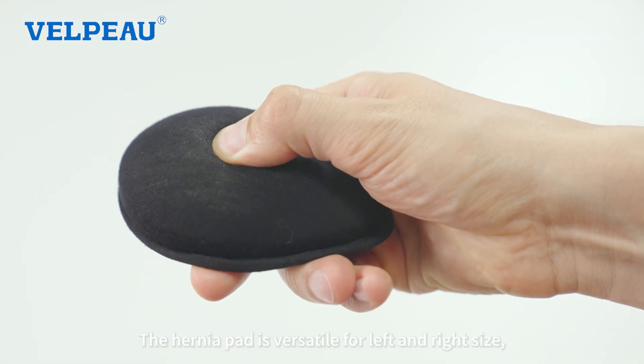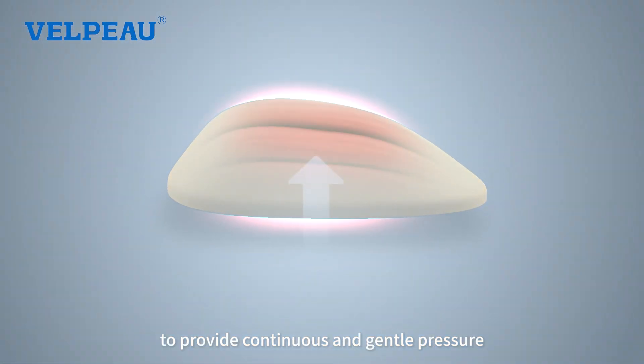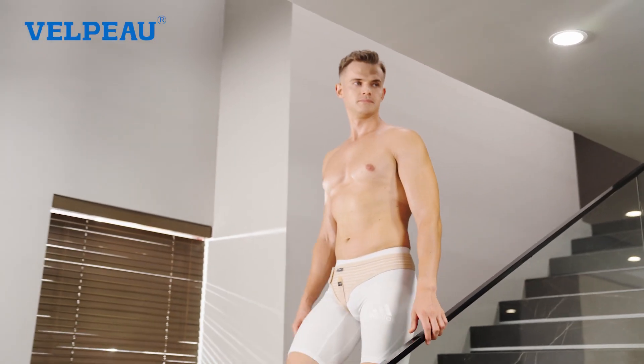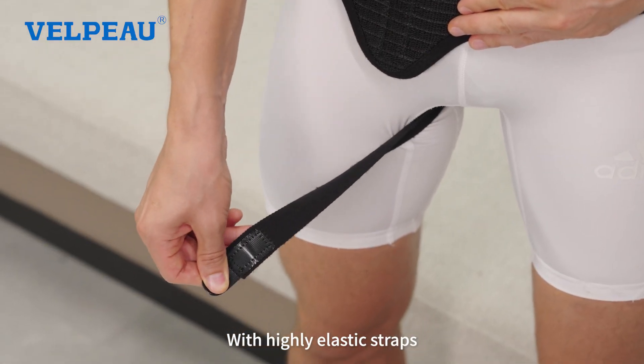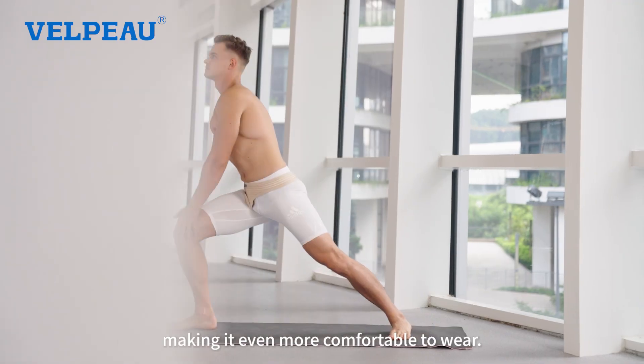The hernia pad is versatile for left and right side, mimicking the elasticity of muscles to provide continuous and gentle pressure for hernia relief. With highly elastic straps, adjusting the tightness is effortless, making it even more comfortable to wear.